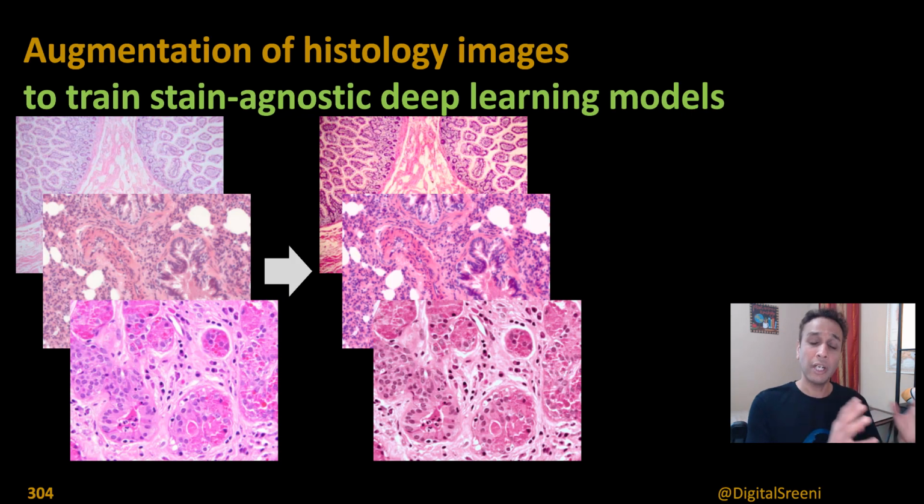And we converted our input images to LAB space because in RGB space, R, G, and B are not independent, but once you move to LAB space, they're a bit more independent than RGB. Okay, why am I explaining all of that? I should probably request you to go back and watch that video.